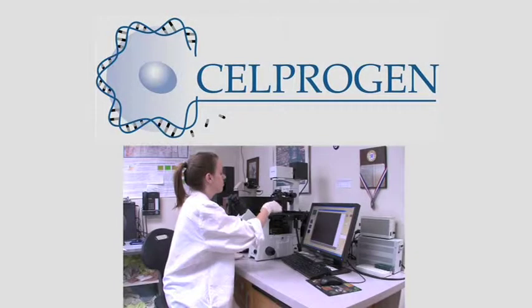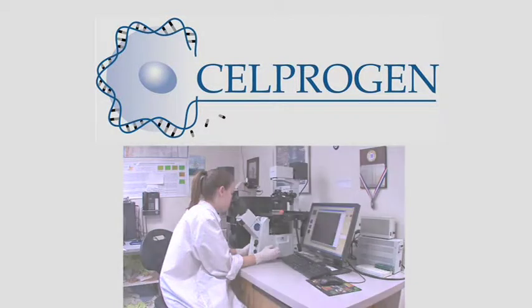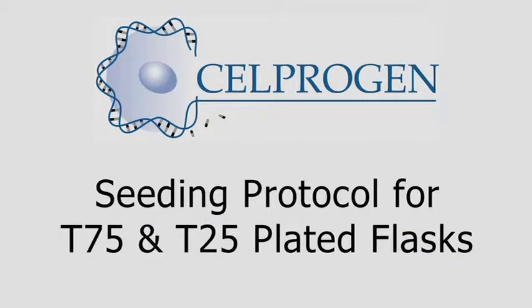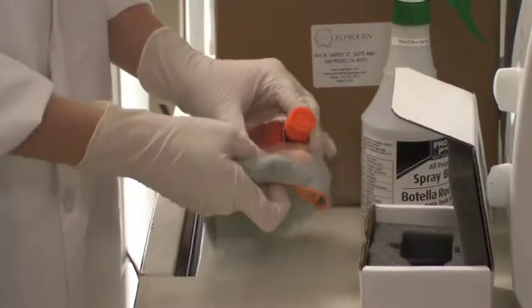Celprogen bases its excellent reputation for quality and product purity by adhering to a strict regimen in the lab. Here's the correct procedure for seeding plated T75 and T25 flasks. Wipe down the fresh flask with 70% alcohol upon arrival.